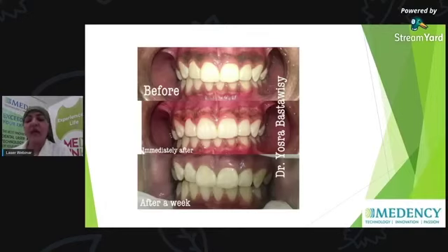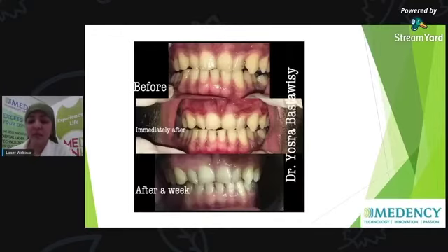After 1 week, if you feel like you left some pigments, you don't want to reach the bone, so you will wait 1 week and see the follow-up. If the follow-up is good, okay, he doesn't need any other sessions. So as you can see, after 1 week, it's perfect. There are no pigments at all, and the patient was very satisfied. Another case, before, immediately after, and after 1 week, it's perfect, no pigments at all, and complete healing.